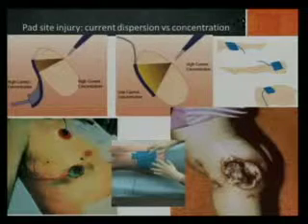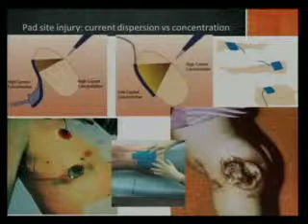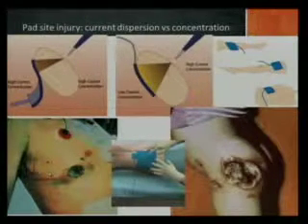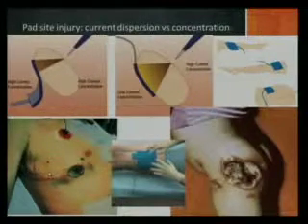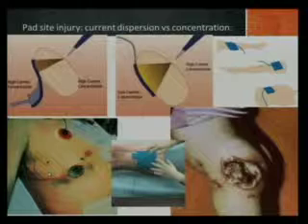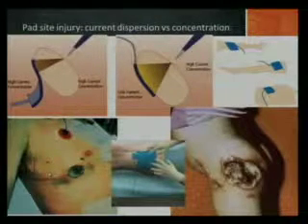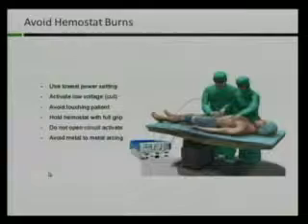And then this picture here on the bottom just talks about alternate site burns. So this is an electrocardio monitor that's placed on the patient. And remember, electricity is seeking the ground. It wants to go back to its source. If there's, for some reason, a block or slow return to the generator, which doesn't really happen anymore now that we have these pads that are able to sense that, the current can seek alternative sources and you can get burns. That's why we tell patients no jewelry and stuff, but it doesn't really happen anymore with, thankfully, the advances that we have.